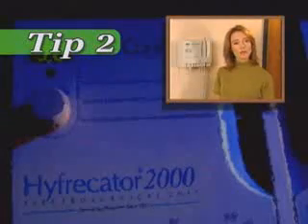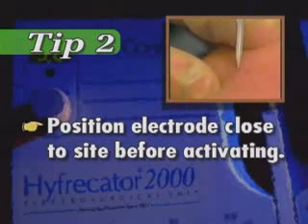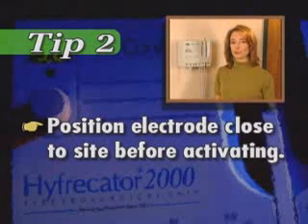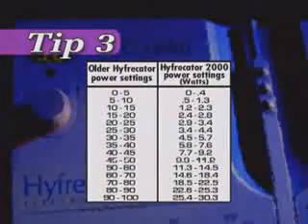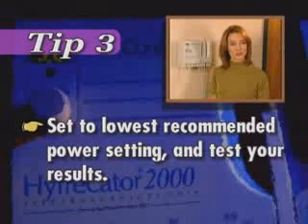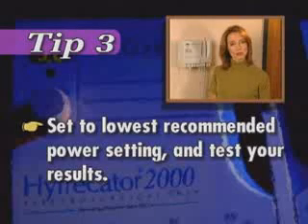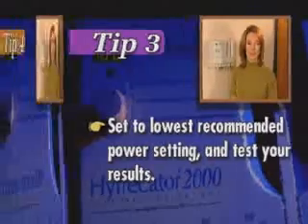Tip two: when you're about to use the pencil, position the electrode close to the surgical site before activating. This will minimize the electrical spark gap between the electrode and the tissue so the patient isn't surprised by a jolt. Tip three: if you own an older Hyfercator and are not sure of the power setting at which to set your new Hyfercator 2000, consult your power chart. Set the instrument to the lowest recommended power setting and test your results. If you need more power, slightly increase the level and test again. Remember to start low and make small incremental increases until you get the effect you want.